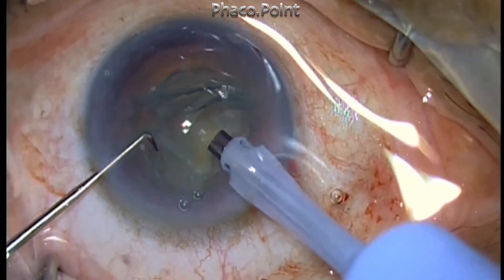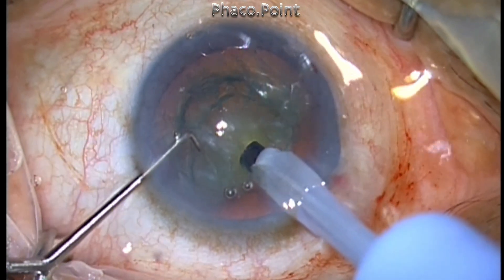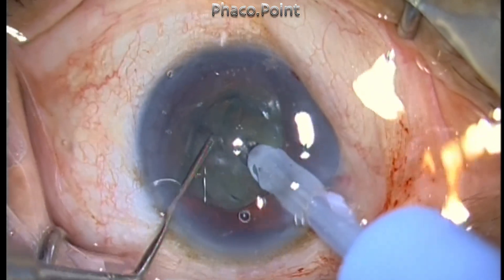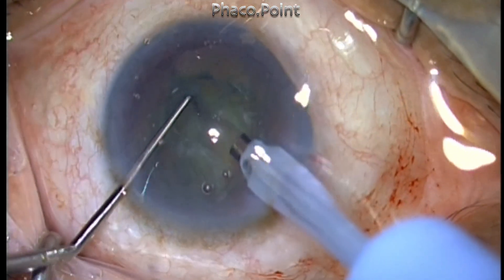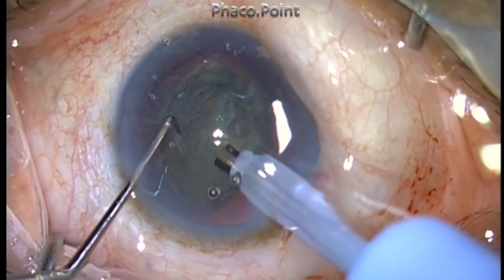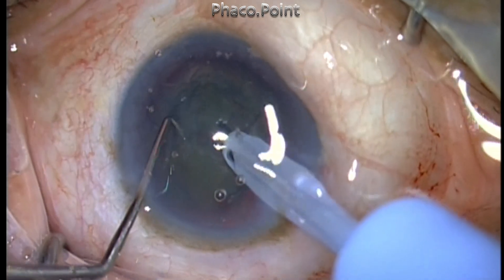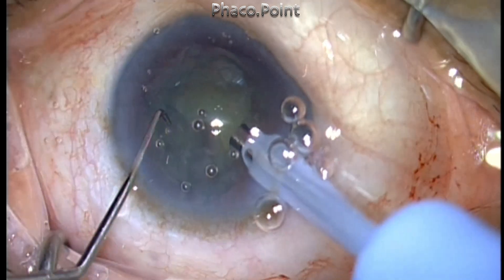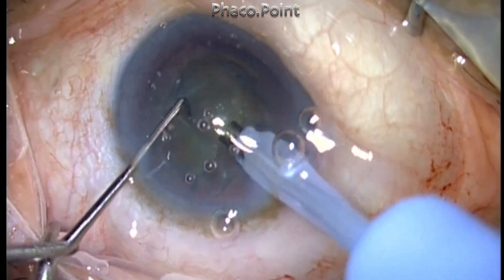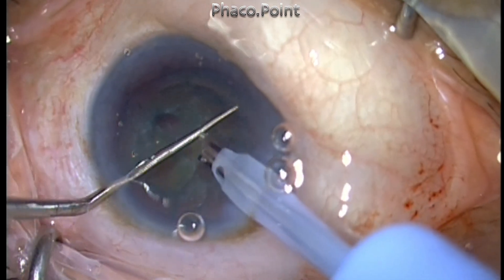In spite of this, I decided to go ahead with the soft chop technique, where I use low power and high vacuum to hold the nucleus and then try to crack and chop it. The first thing I do is try to impale the nucleus using very low power but reasonably high vacuum, and I'm able to get my first chop. But then when I do the subsequent handling of the nucleus, I found that there was a lot of cheese wiring happening in spite of the extremely low power of just 20%. Because of the cheese wiring, the vacuum didn't kick in and I was not able to pull the nucleus firmly into the FACO probe.